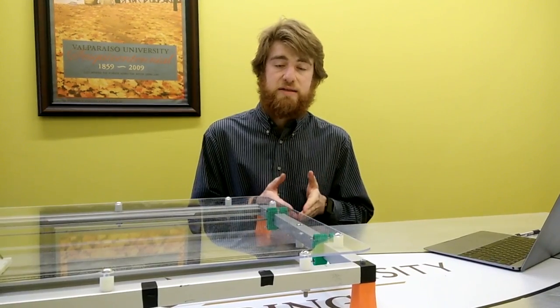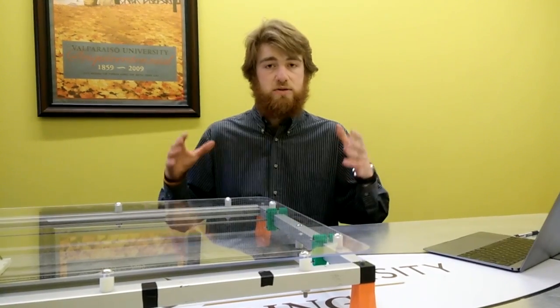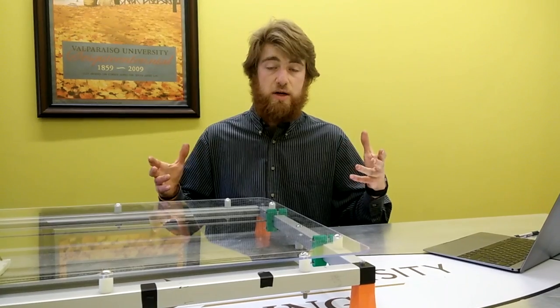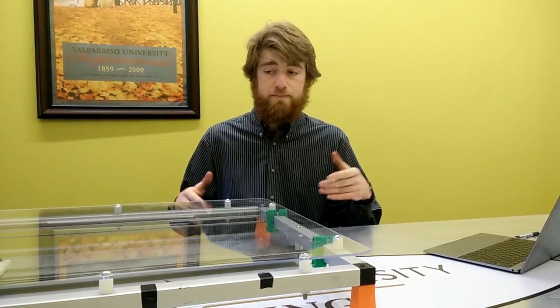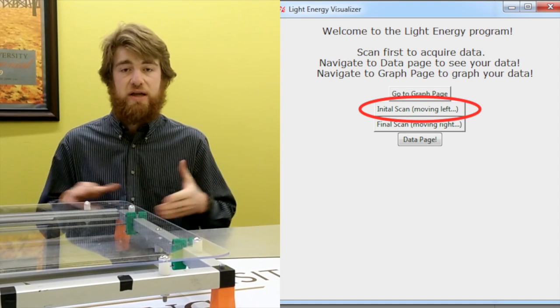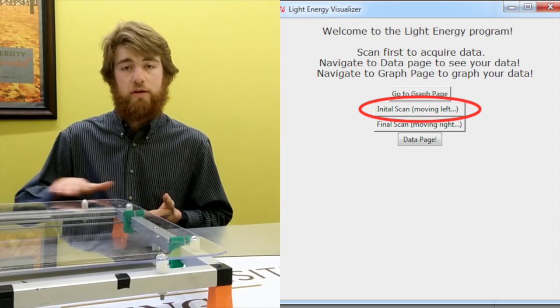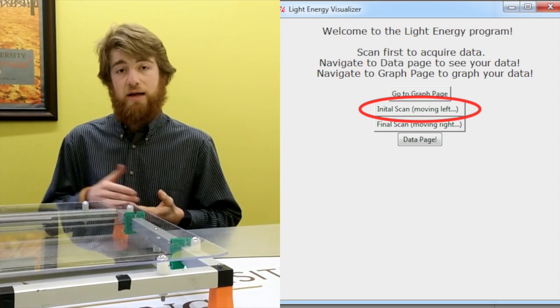First, the infant is taken out of the crib and the scanner is placed into the crib with the lights on in order to treat jaundice, so the phototherapy lights are turned on. Then a scan is taken of the crib in order to gather the total light energy hitting the surface of the crib. The infant is then placed on top of the clear cover on the scanner, and another scan is taken.